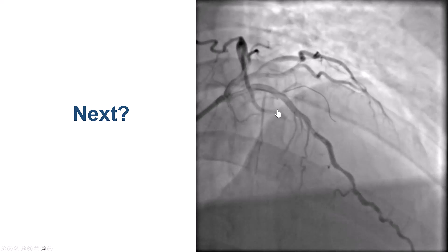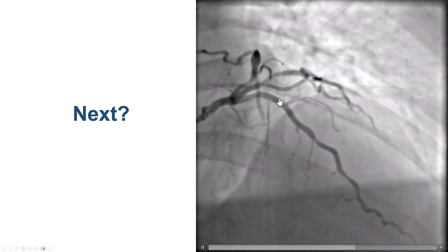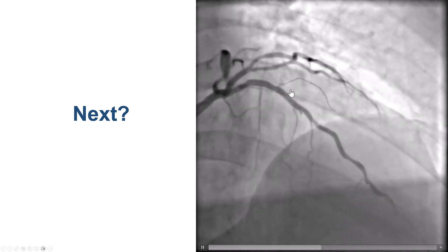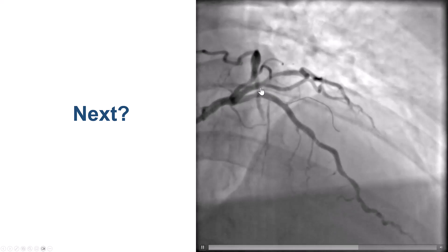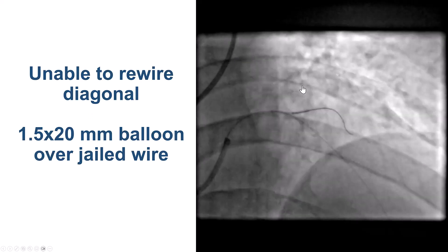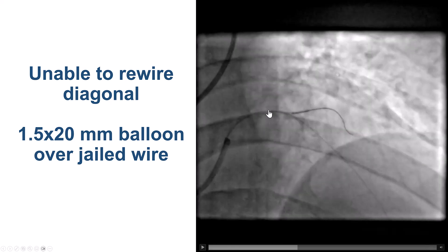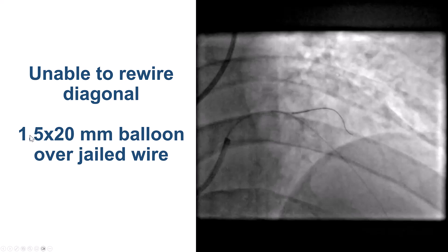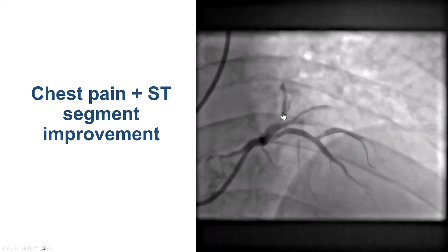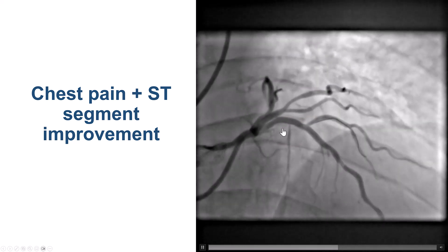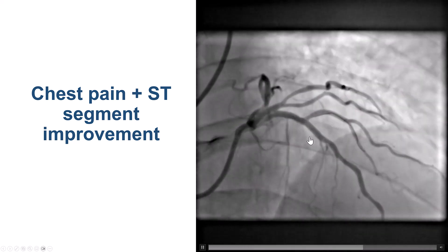Unfortunately, instead of having improved flow in the diagonal, we actually lost flow in the diagonal. The patient did have some chest discomfort and ST segment changes, so clearly this was an important branch. The next step is to try to rewire the diagonal branch and perform balloon dilatation, but we were unable to advance a guidewire. We ended up using a small 1.5 millimeter balloon over the jailed wire, ballooning in the diagonal, and after doing that we restored good TIMI 3 antegrade flow, and the EKG changes and chest discomfort both resolved.